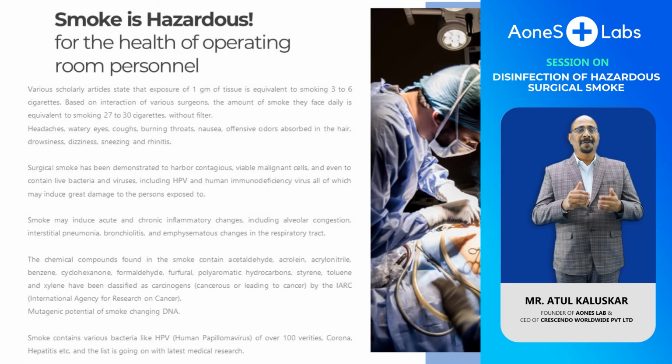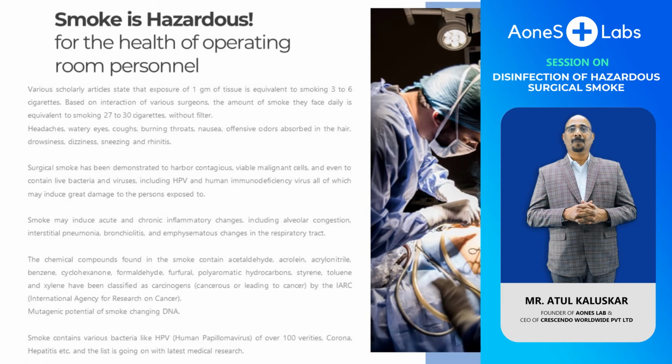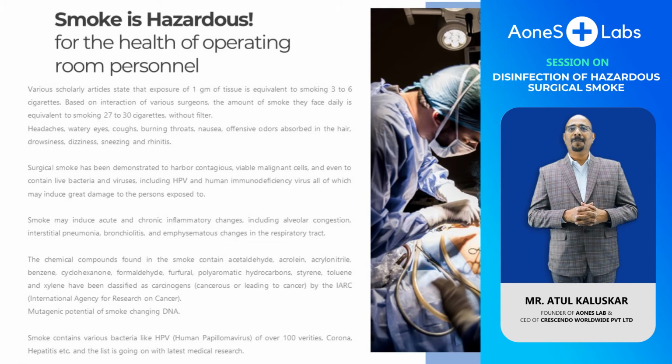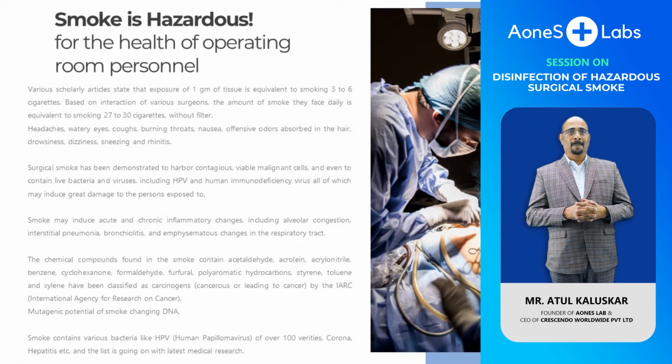Now come to the Indian situation. Most of the surgeons are aware of the potential risk of surgical smoke to themselves, the operation theatre team, and even the next patient. However, I have found that very few surgeons and hospitals are using any mechanism to disinfect this hazardous surgical smoke.